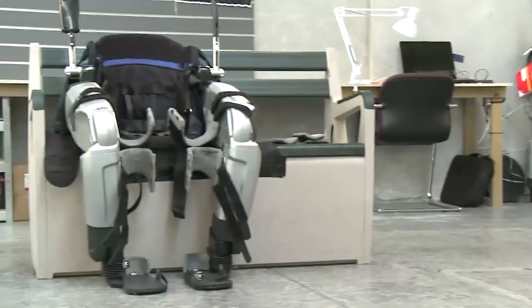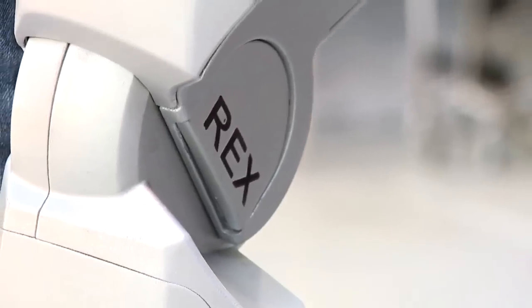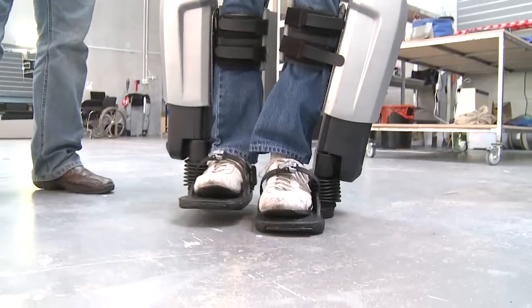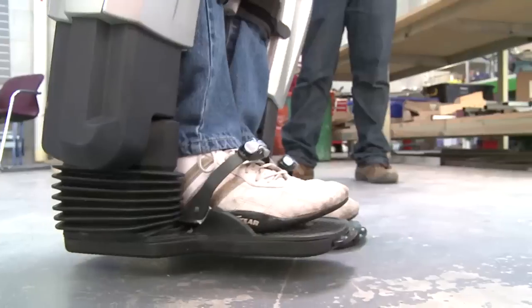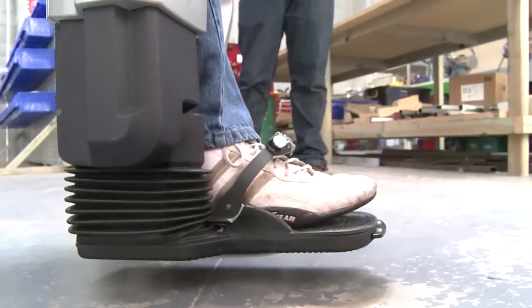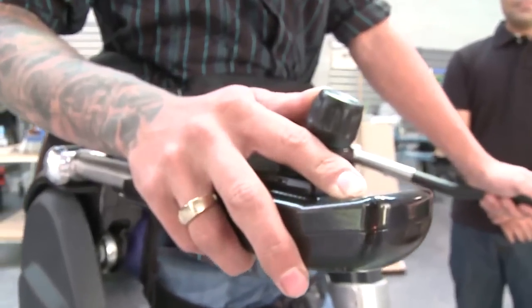I find the Rex legs are really easy to use. It took us about three days to get myself fitted properly and end up walking around, so from someone that hasn't walked for five years I would have expected it to have taken longer, but it didn't. Once you know the functionality and the movement of the actual legs it becomes extremely easy.